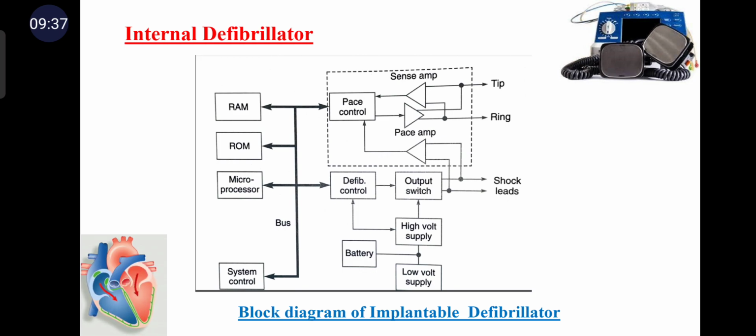The major components of these circuits are the battery, DC to DC converter, output storage capacitors and high power output switches. Usually the DC to DC converter used to convert the 6 volt battery to the 750 volts is of classical configuration. It is operated at a high frequency, in the range of 30 to 60 kilohertz, as a practical matter to facilitate the use of the smallest possible core. The storage capacitors in this circuit are typically aluminum electrolytics, because of high volumetric efficiency and the working voltage required.